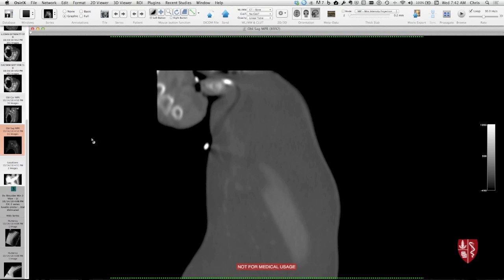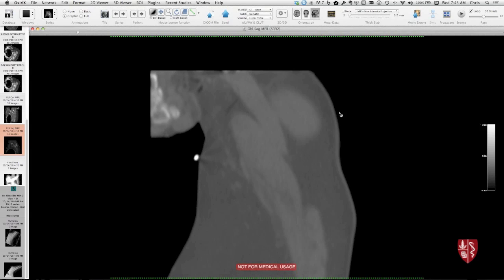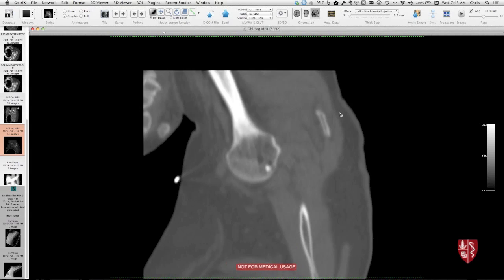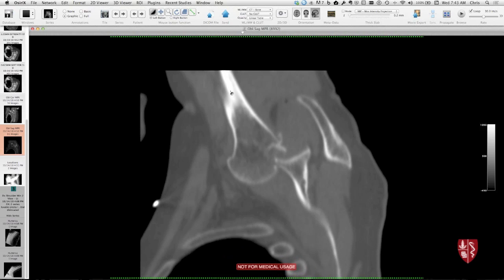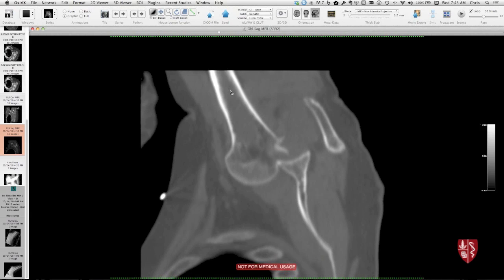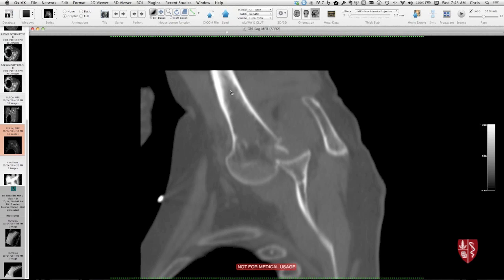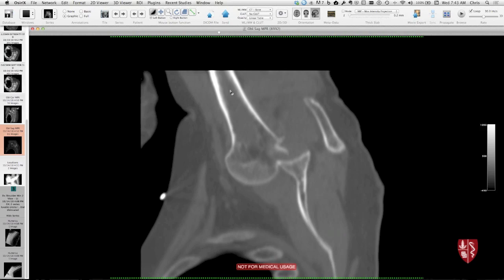In this case, the patient got a CT scan, and in this oblique sagittal plane you can see — so here's anterior, posterior, here's the glenoid, here's the humerus that's perched on the glenoid, and the arm is up in this patient. So a little bit of a tricky patient to position for CT. This is a pretty uncommon type of dislocation — luxatio erecta.